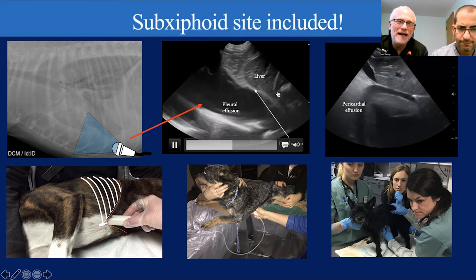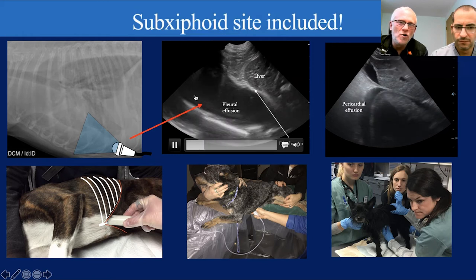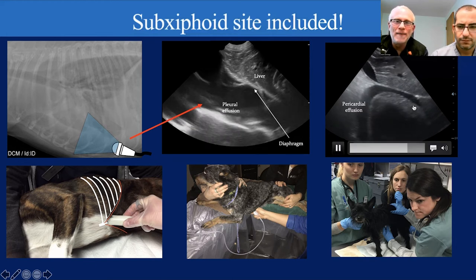This is the cat that we have on the left here. It's got a liver, large falciform fat. So we know it is a cat that we're looking at. There's our diaphragm. And look at all that pleural effusion tracking along, outlining the diaphragm beyond the diaphragm in this window here. And same thing over to the right, Dr. Chalhoub.